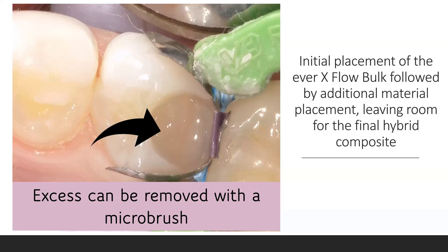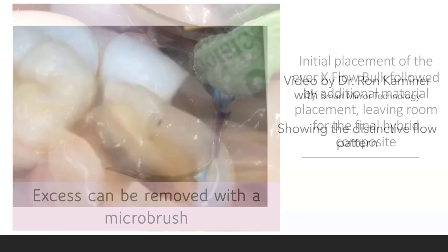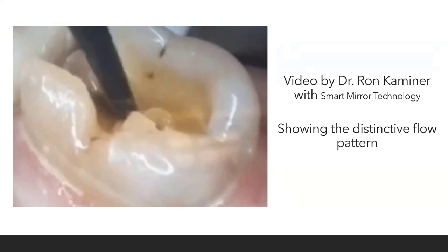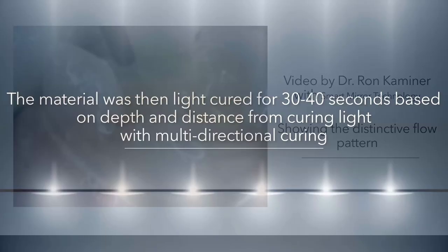This shows how the material flows in — it looks like a Vaseline. When you cut a crown prep, it integrates right into that margin, shown via smart mirror technology. Now you've got to light cure this material — don't under-cure. Yes, it's translucent; yes, it's a bulk fill. It's going to be 30 to 40 seconds using multiple directions because you could have undercuts. Absolutely multi-direction cure everything.